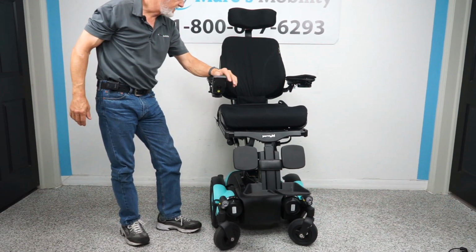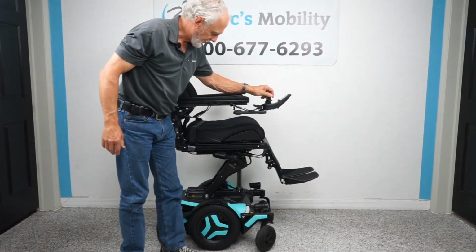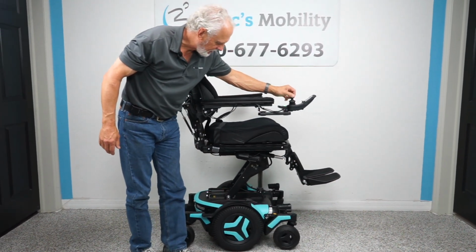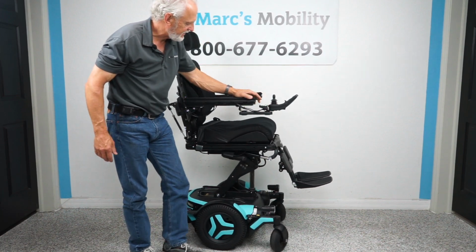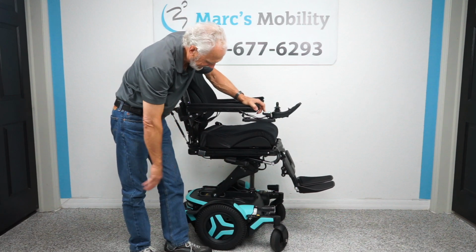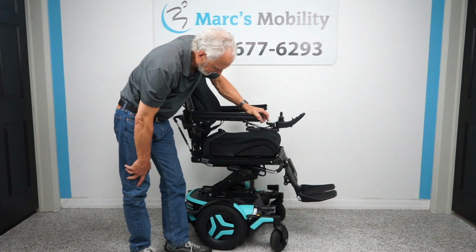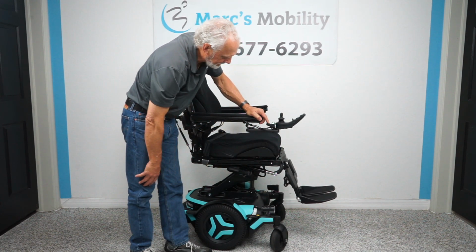Let's put the chair back sideways so we can see in the video. So now we've got the seat elevated. Let me show you something else too with this, what's nice about these seats. Let me bring this seat halfway down. So I'm bringing the seat down now. I'm going to go halfway down. Okay, I'm going to bring the feet in.